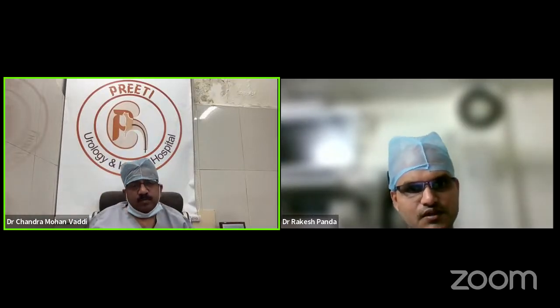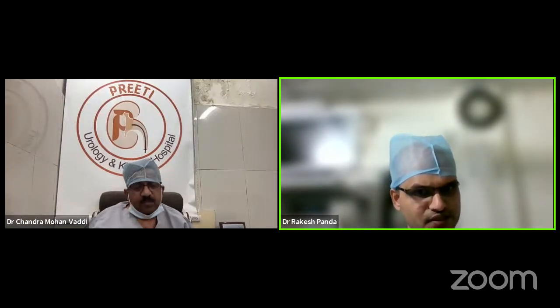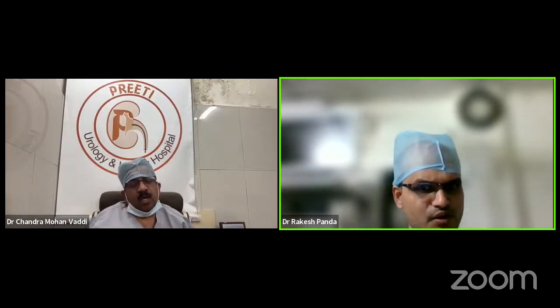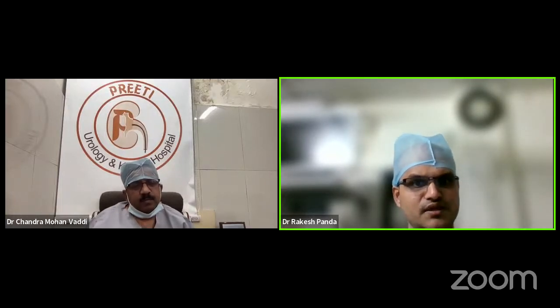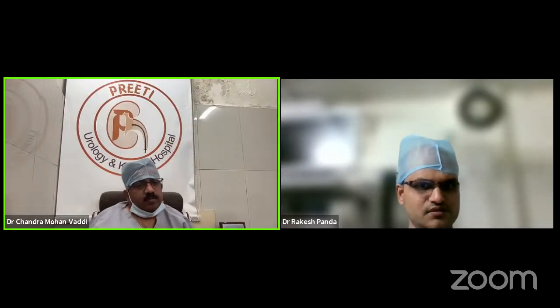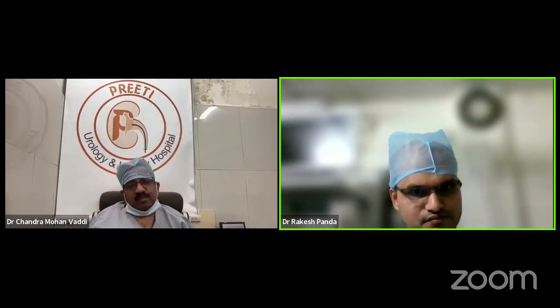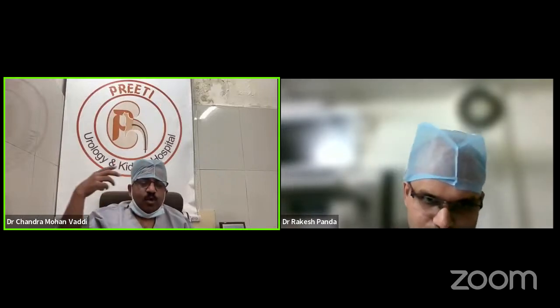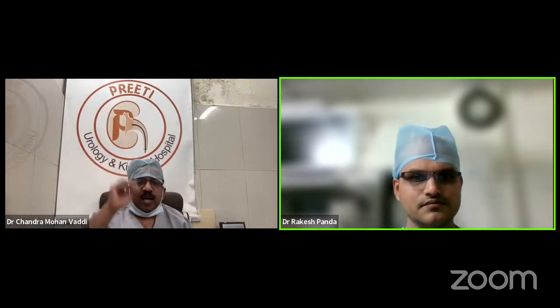What are the conditions where supine is very useful? Supine is very useful if the kidney has a bifid or trifid system, long narrow infundibuli, and if the patient has any cardiorespiratory problem, or the patient positioning cannot be done in prone, like kyphoscoliosis, and any single functioning kidney. Multiple medium-sized stones, in such cases you can put them all into the pelvis, puncture with supine PCNL and remove. Multiple small stones, anyway RIRS will be done.